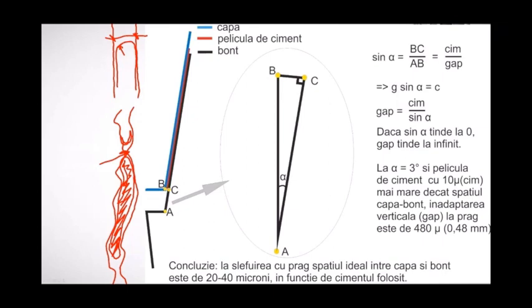So if you don't do a shoulder there, you won't have a gap. It's going to be just an adaptation between B and C. What, 20 microns? Nothing. It doesn't matter. So it's easier, isn't it? If you don't have this shoulder, you don't have this gap.